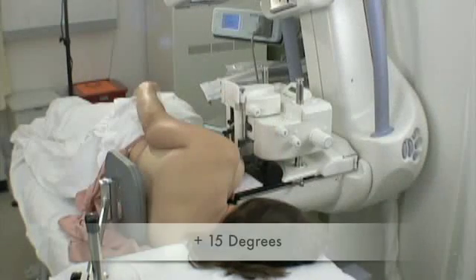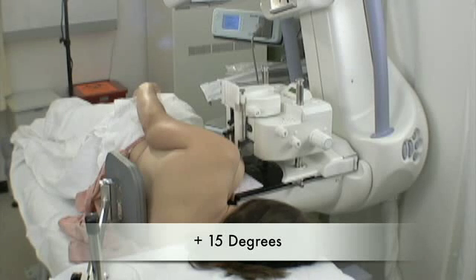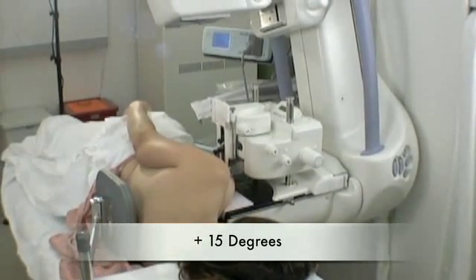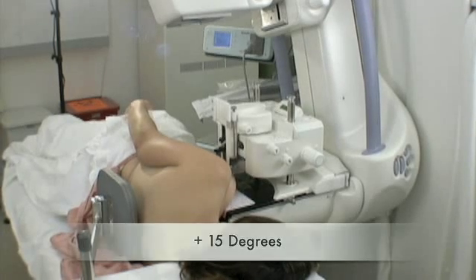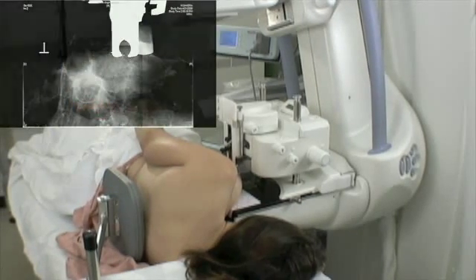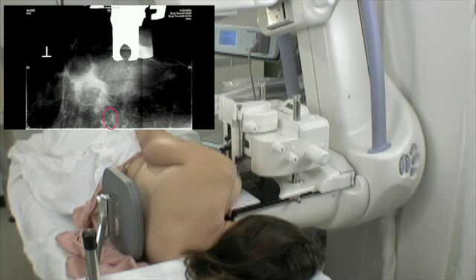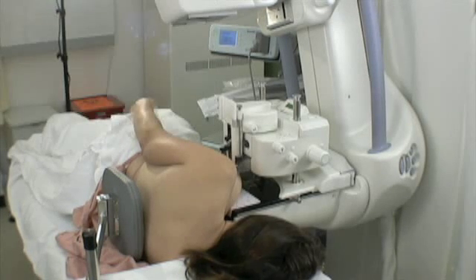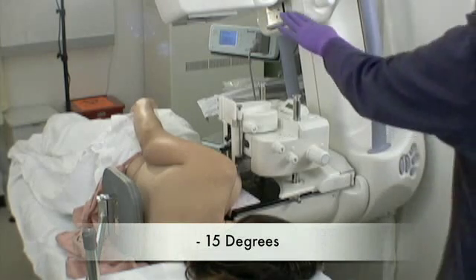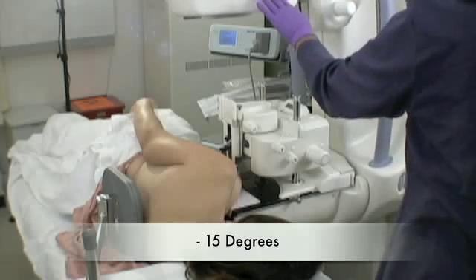In a moment we'll prepare our stereotactic views. We have angled the gantry plus 15 degrees off the central axis for the first stereo image. As soon as this image comes up on the monitor — looks beautiful — we will angle the gantry minus 15 degrees for the second stereo image.